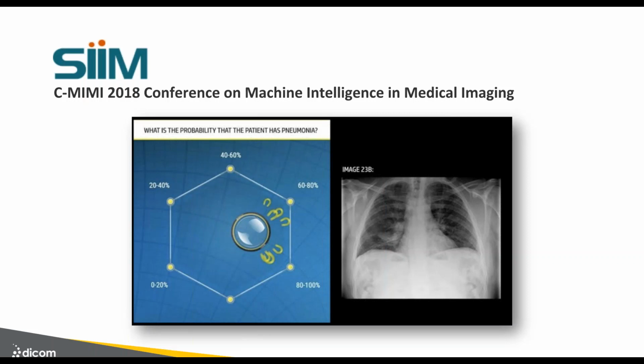In this case, you had 7 of them collaborating on this particular X-ray to see where they would land on a diagnosis of pneumonia. And so you can see in this model that there's essentially a crowdsourcing of the diagnosis going on, which is a really interesting way to solve one of the key problems in the training of algorithms, which is the dilemma that we have.